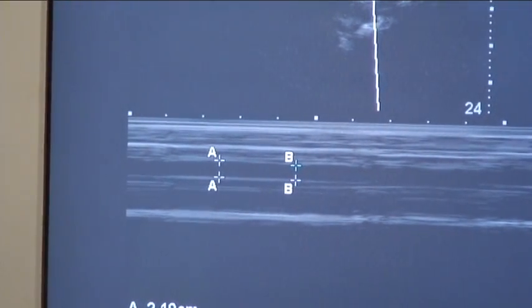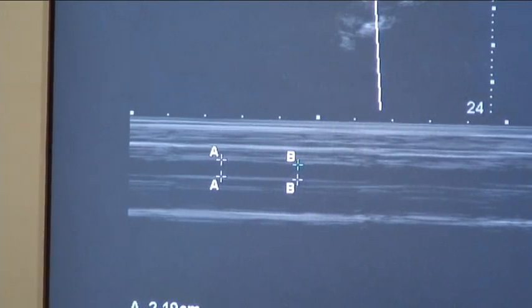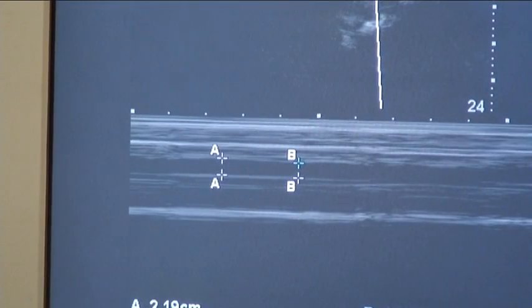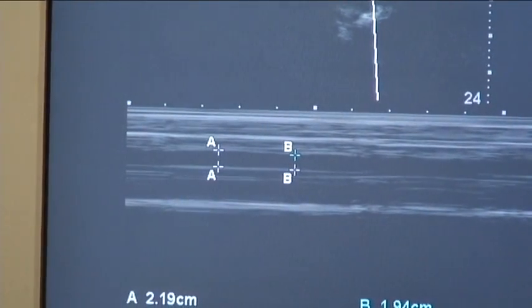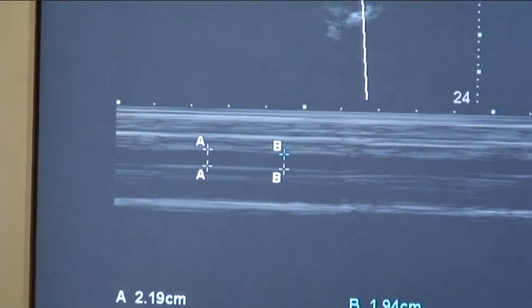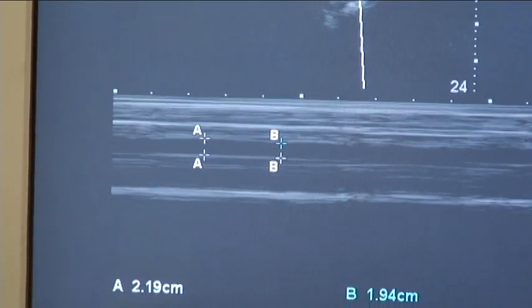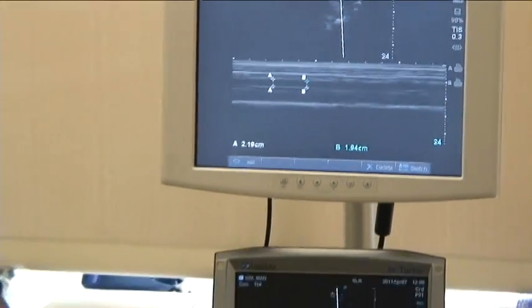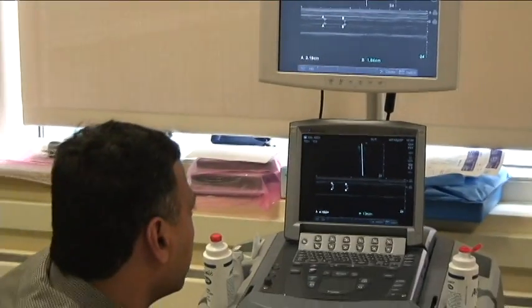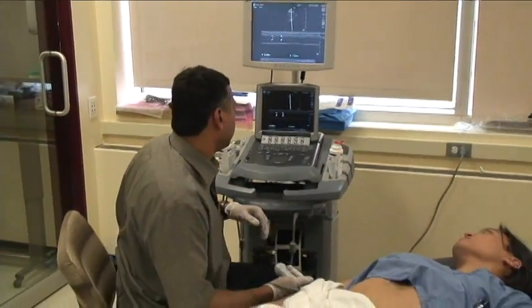So now we have during expiration, that's when, in a spontaneously breathing patient, you would expect the IVC to be of larger caliber than during inspiration, where it goes down here. And that's B point. And that's what we're going to be using for fluid responsiveness, which is called the IVC index, and different sizes of the IVC and different variation in respiration will correspond to a different CVP.